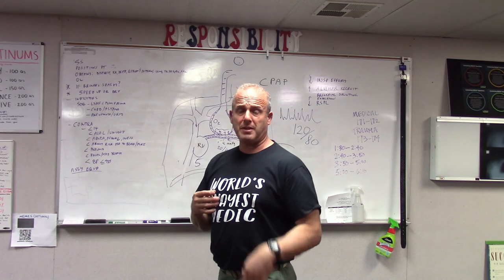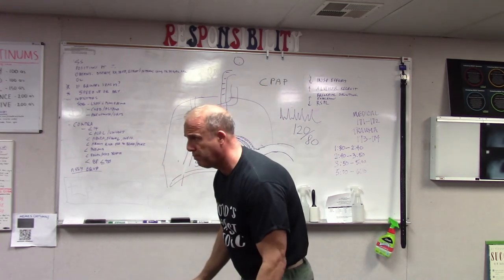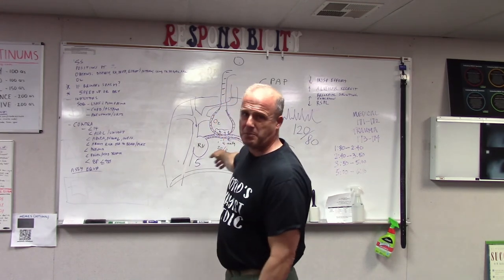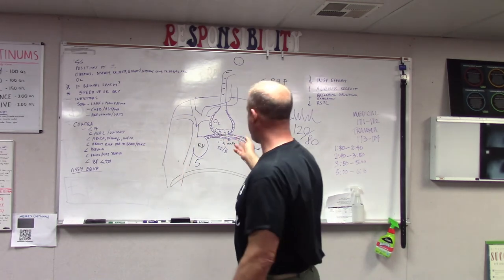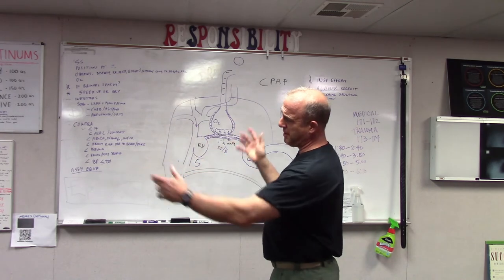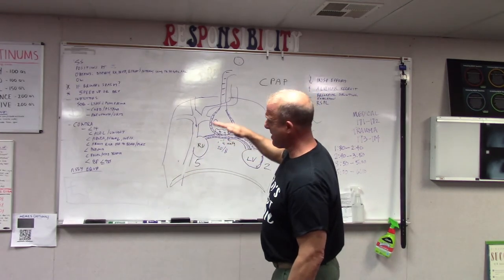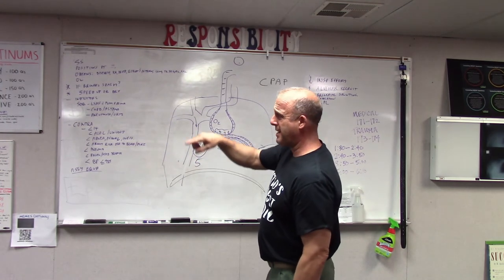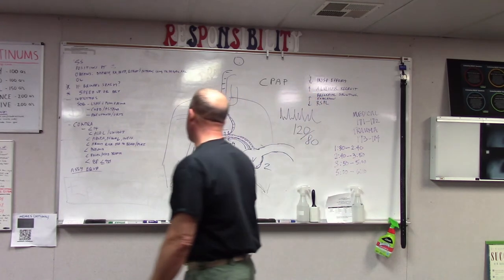Although I don't really know what Lamaze breathing looks like, I'm emphasizing blow air out. Blow air out. And with the CPAP splinting the small airways, that should help. A little bronchodilation, that should help. If you're really cool, you'll flip your monitor and show them their CO2 waveform. Tell them, breathe that down. Make that number lower. And oh, by the way, that wave, make it as long as you can. Cool trick, biofeedback works.